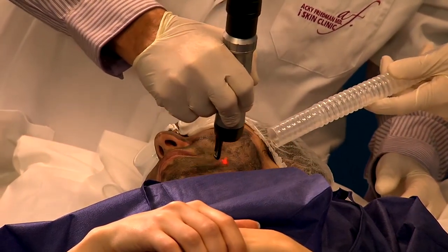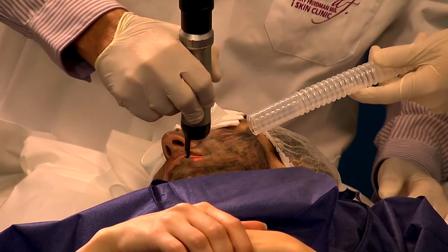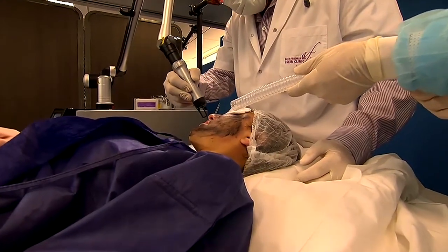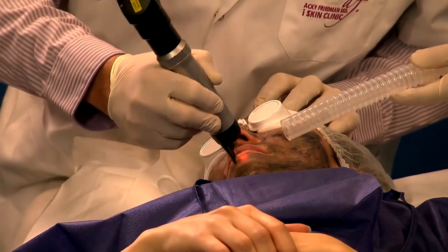You have to keep moving even though it's not a painful procedure. You don't want a patient to feel any discomfort during the procedure, and it's something that can be done very easily, very quickly as a lunchtime procedure.